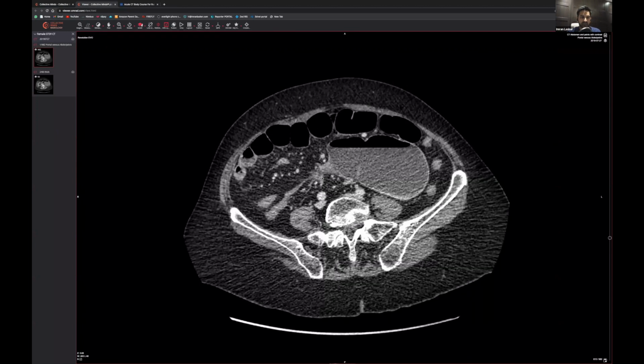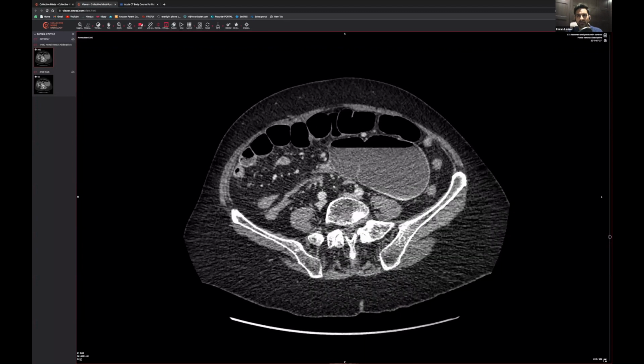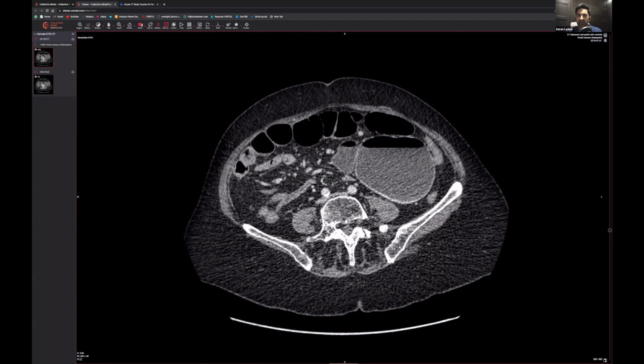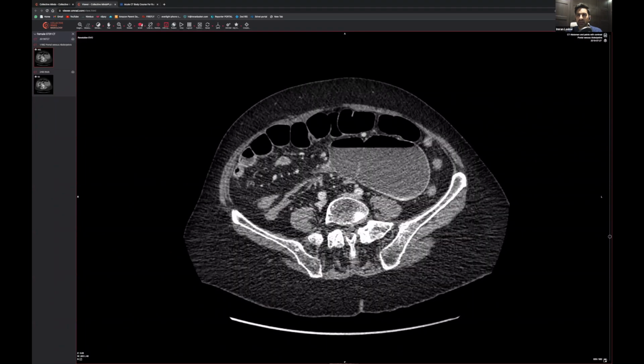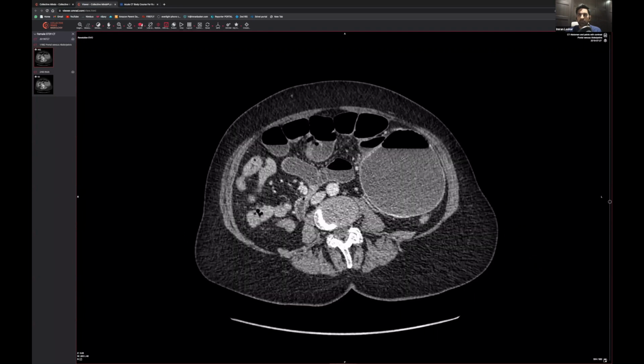So we're in the region of the ascending colon, but there's a weird sort of stricture or something. Yeah, someone said stricture, which is not a bad shout for what's going on here. It does look like it comes up this way and then twists along this way. So what I initially thought could be the stomach, actually this is not the stomach. What could it be?